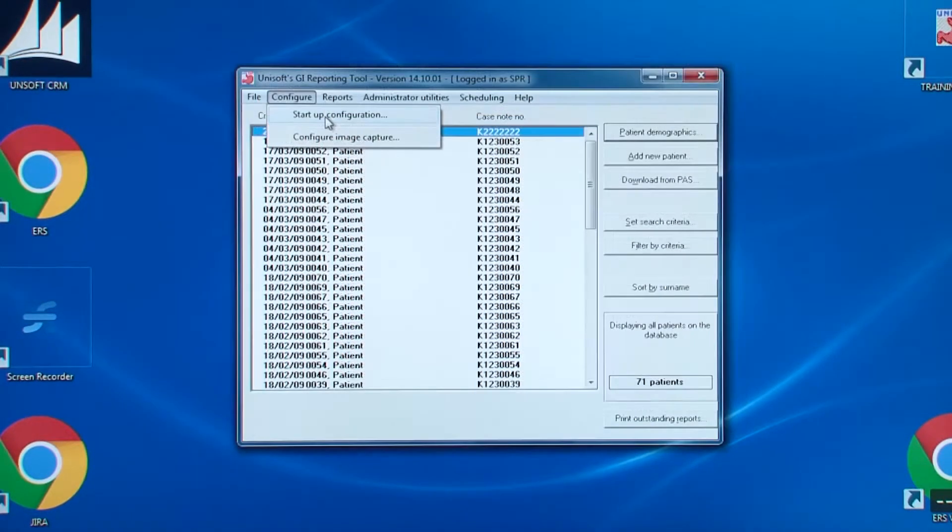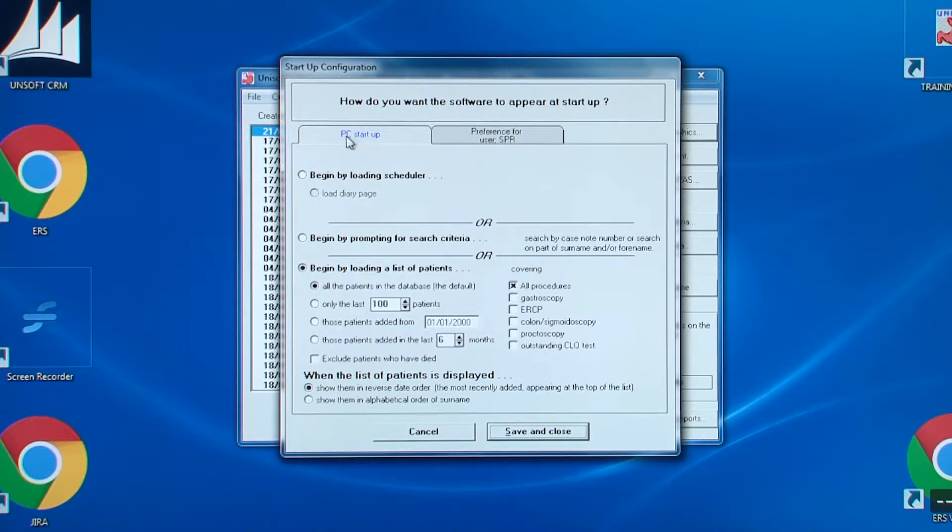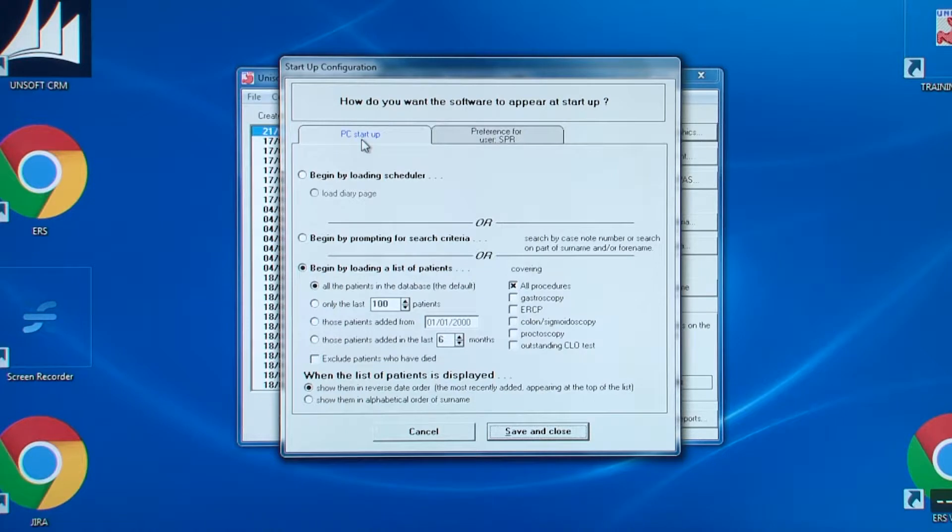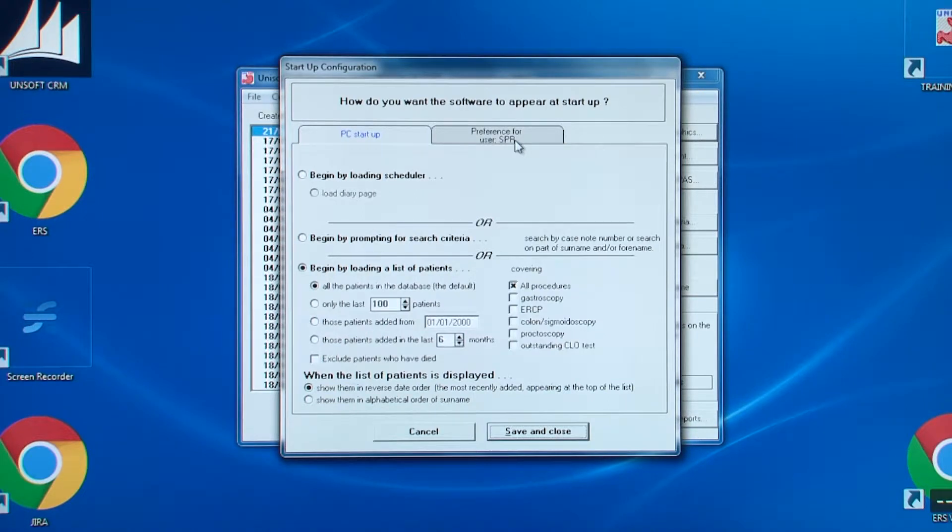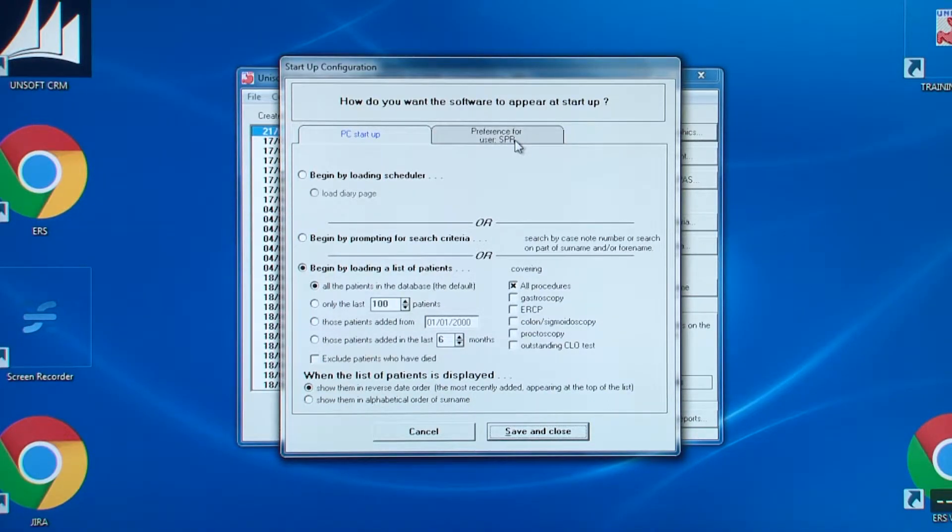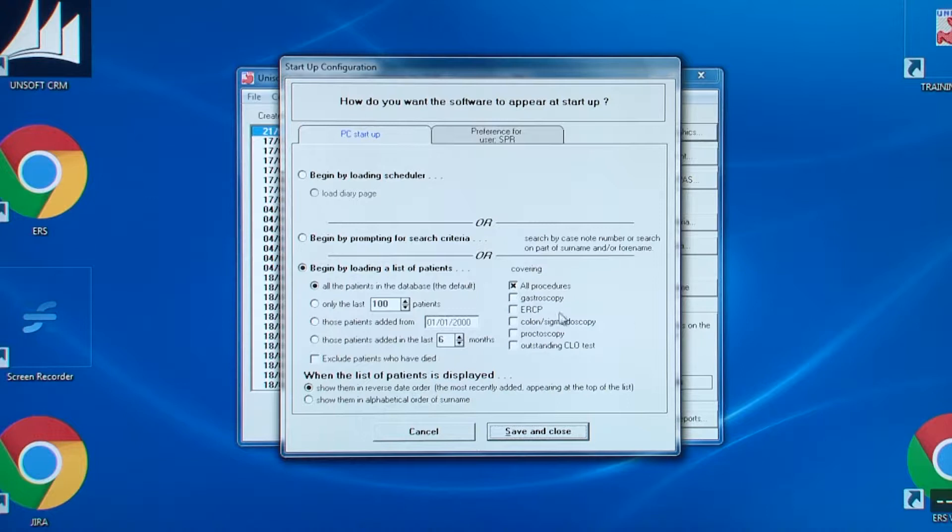There are two tabs at the top of the screen. One is for the start-up options on this PC and the other is for the start-up options for this particular login. Now if both login configurations are different then a message will appear when the user next logs in asking which one you want to apply, your own or the PC start-up.